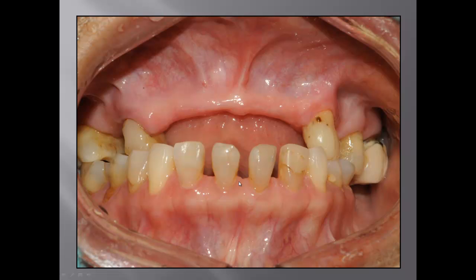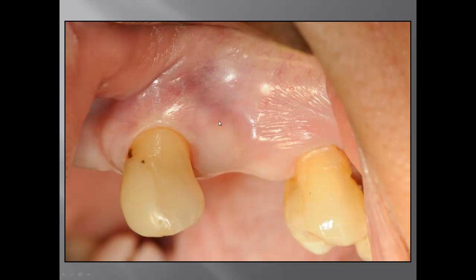We start by placing the implant on the upper left at tooth number 12. You can see from this picture we have buccal concavity, because this tooth was extracted a long time ago and the bone has shrunk. This is the buccal view — the distance between number 11 and number 13 is very big. She has small teeth but a big jaw, and we have to keep this size discrepancy in mind when planning the restoration.